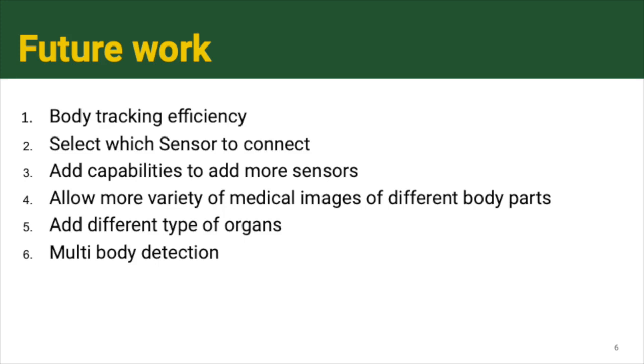To further improve the functionality of the app, more sensors can be added to expand its capability. Currently, it only works with the pulse oximeter. A sensor our client wanted to work with was the Apple Watch. However, through some research, we found that the Apple Watches were not compatible with the iPad device. Therefore, if the technology improves for the iPad, this could be a viable option to include in the future.